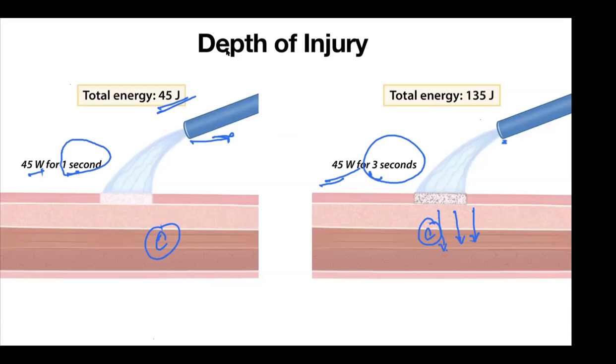APC effect. A lot of fellows think that you cannot perforate with APC because the tissue desiccates and the gas goes to the next area. That is not true. So let us see what happened to this experiment and this experiment.